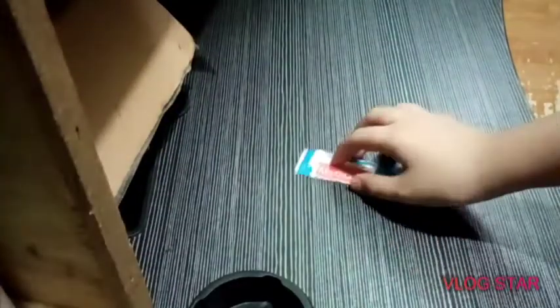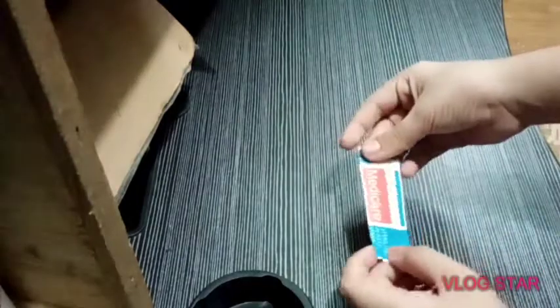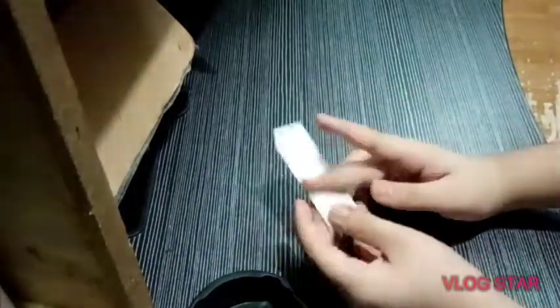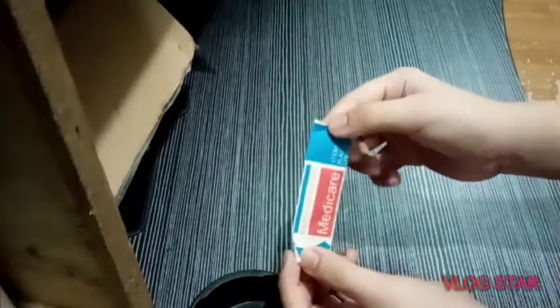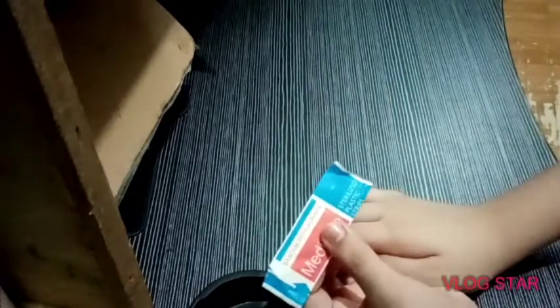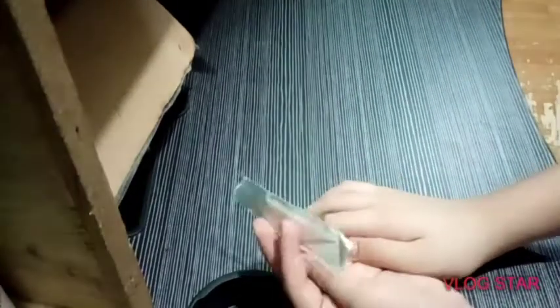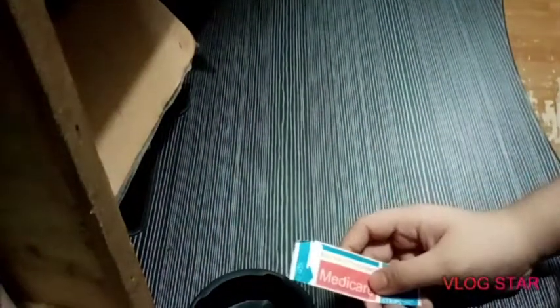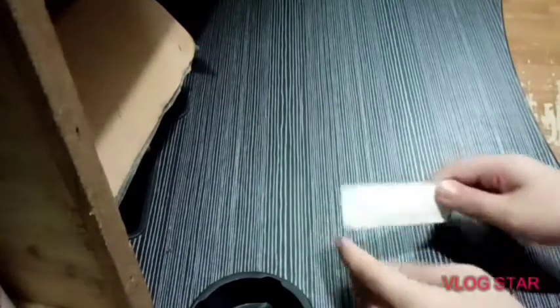So here we go. This is a regular band-aid, or plaster, or sterilized plastic strip. This is a band-aid, or bandage.